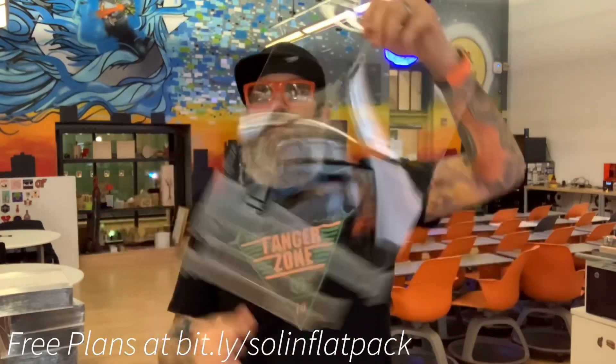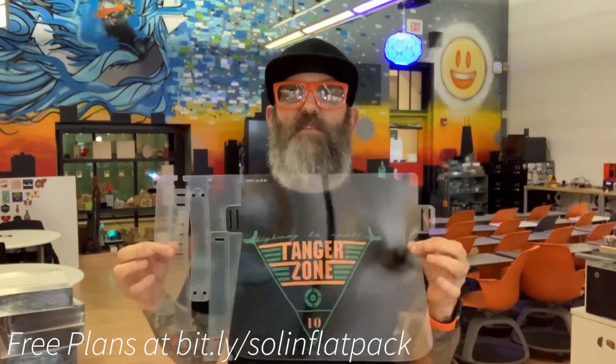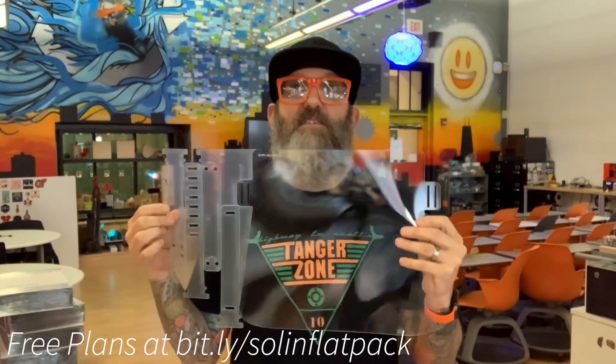This comes in a true flat pack now, so all the pieces are attached and shipped like this, and then you simply break each piece off. I've already removed the protective film off the shield just so you can see through it in the demonstration, and I left it on the other pieces just so that it's easier to see them.